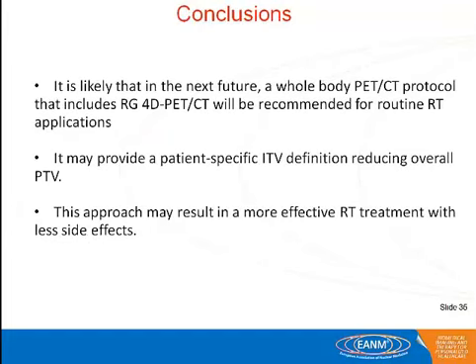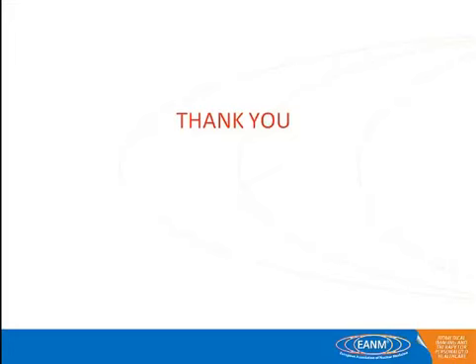We hope that in the future it will be routine, because it can provide a specific internal volume definition, reducing the overall planning target volume. But what we really want is to not treat healthy tissues with radiation therapy. That's what we really want, and to lower side effects from radiation therapy, and also to be more effective and aggressive on what really needs to be treated by radiation therapy. Thank you for all.